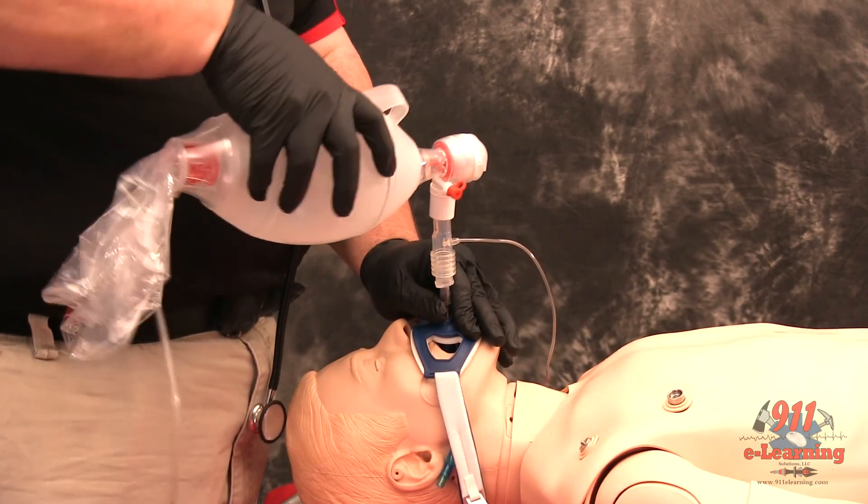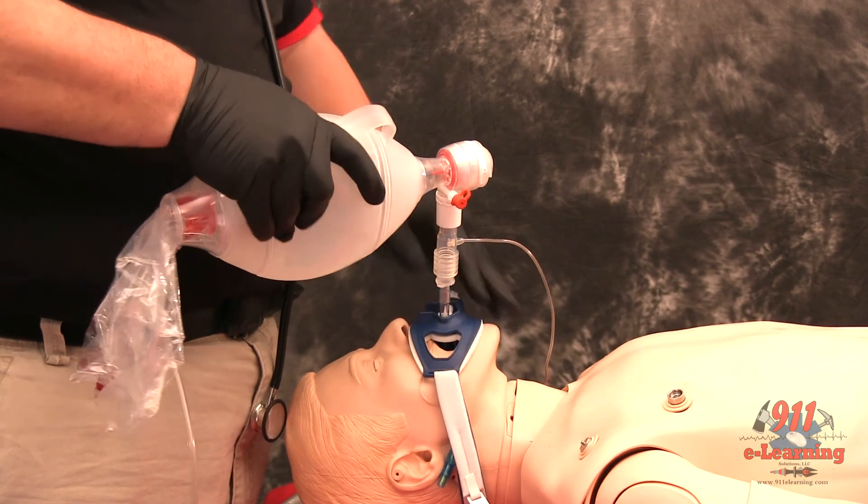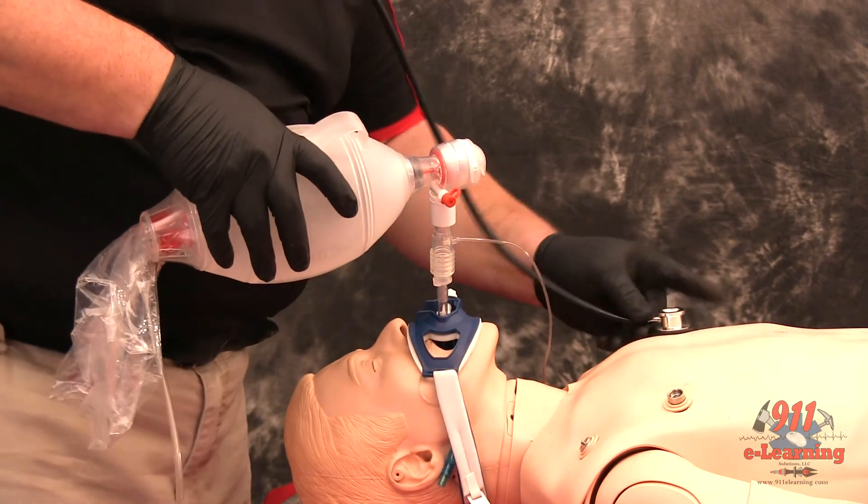It is strongly recommended that an airway evaluation form be completed with any intubation.